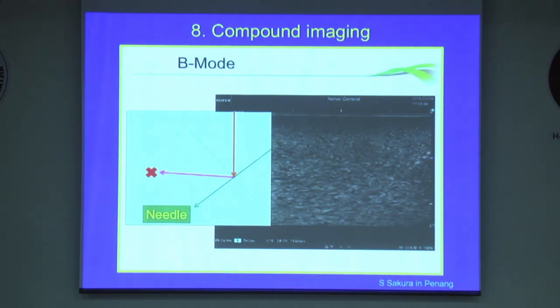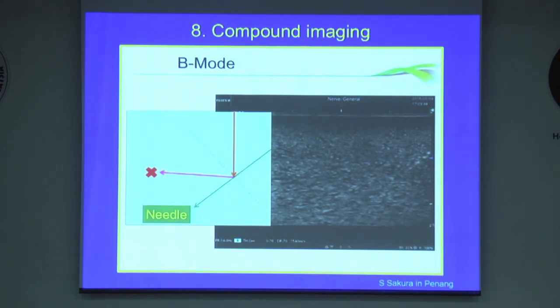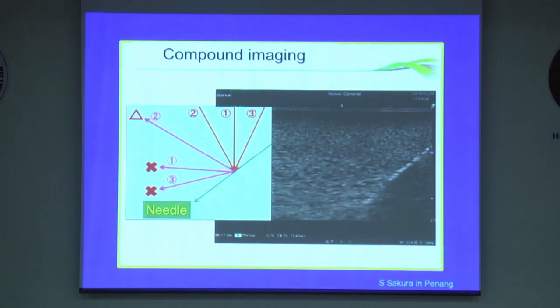With simple beam mode imaging, you would never see a needle that is not perpendicular to the beam. However, luckily, most modern machines use compound spatial imaging mode.